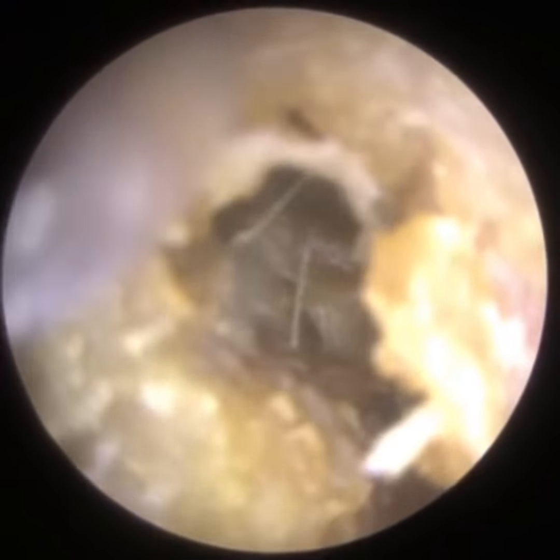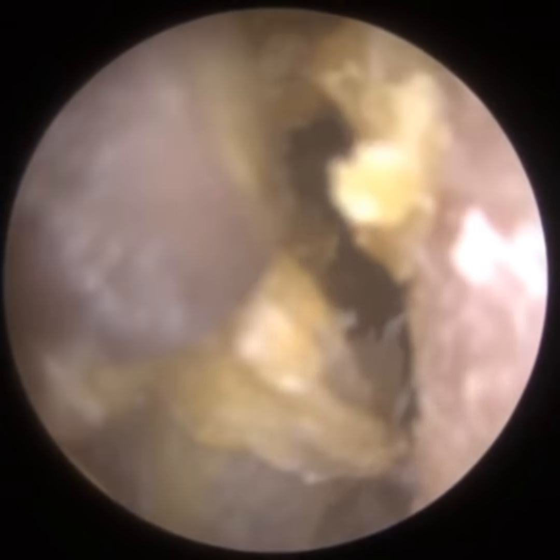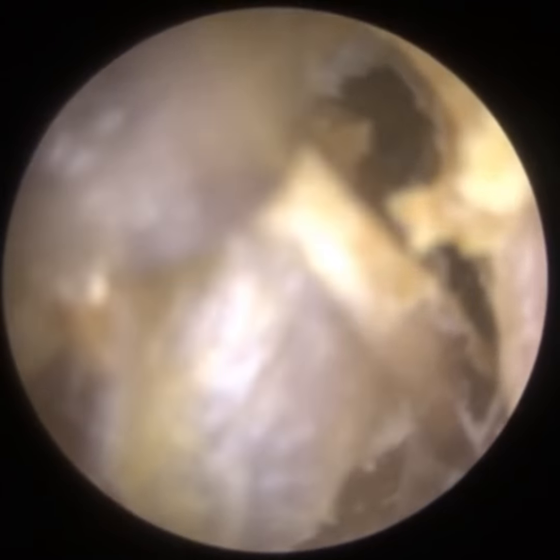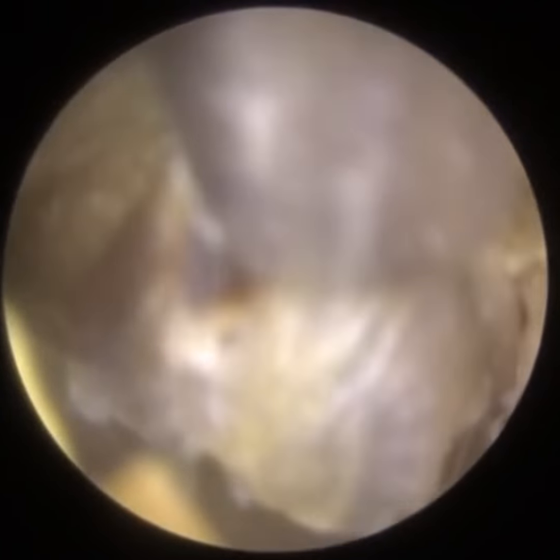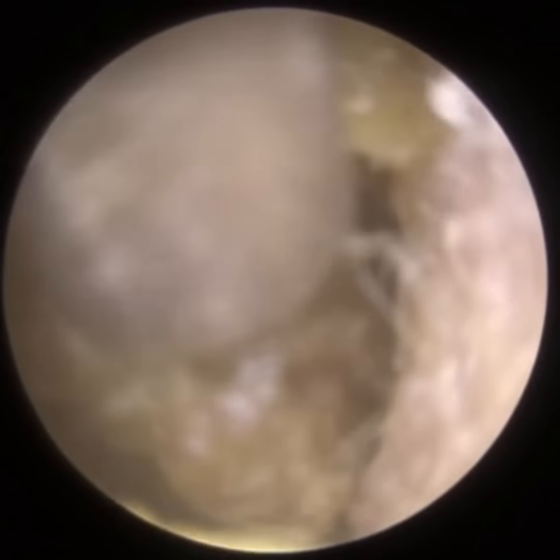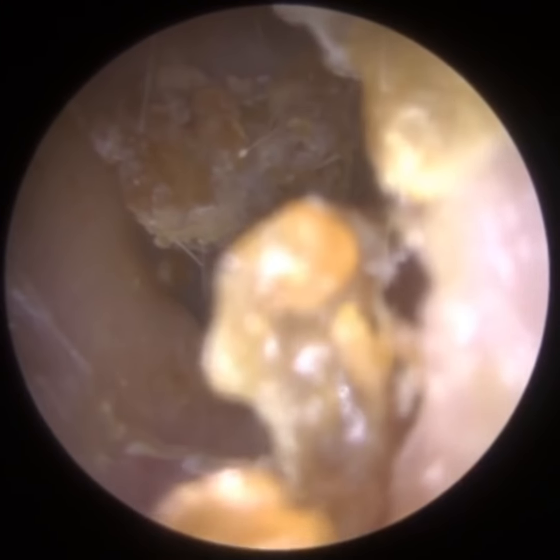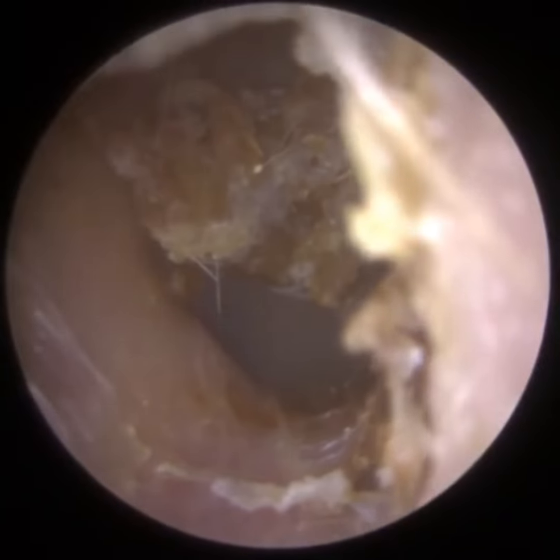So I'm just using suction here. We're just trying to break up this dead skin plug that's near the entrance. Although it has the appearance of earwax, it's actually not. It's more dead skin. And you can see the fresher layer of skin that's enveloped this plug of skin. And the core of the plug, which is what I've got a suction grip onto now, that's the oldest dead skin. So this skin originates from the surface of the ear canal, and then you get another layer of dead skin that appears at the surface, and this one then goes into the ear canal, and you get this constant ribbons of dead skin, really, that crawl over each other as they die and shed, with the oldest layer of dead skin at the core of the plug.